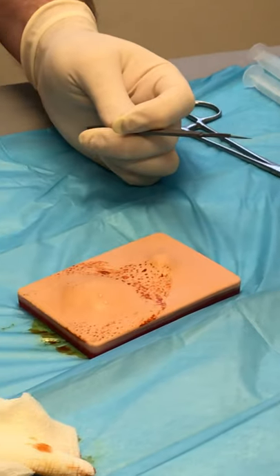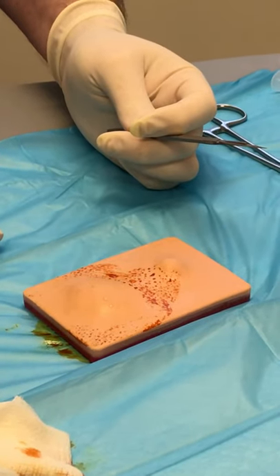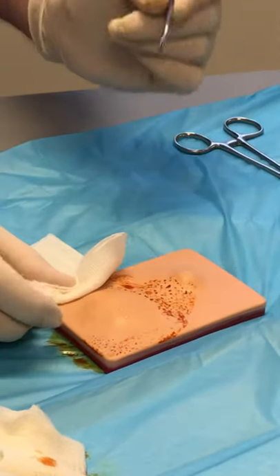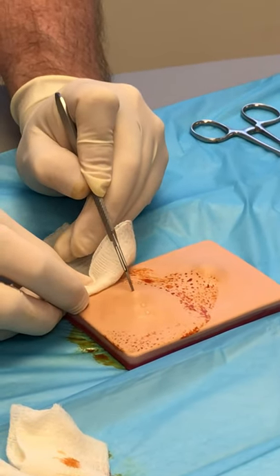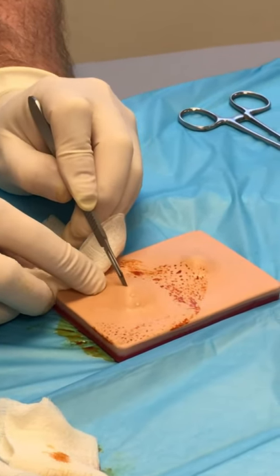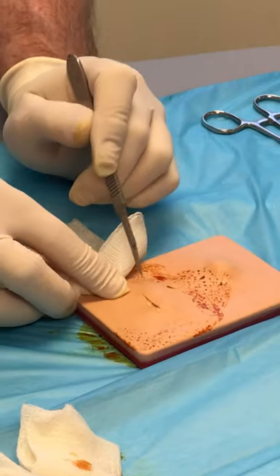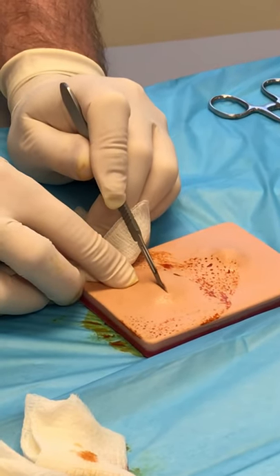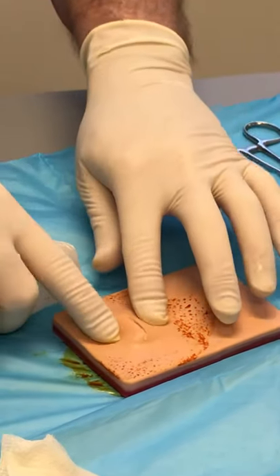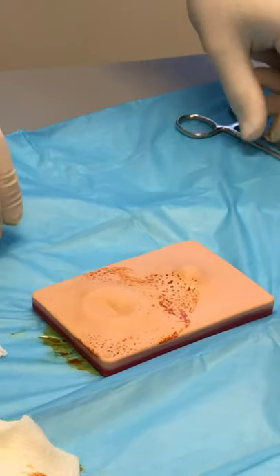When cutting these there can be a lot of pressure under there — think of it popping open like a zit; you don't want a face full of this stuff. If it's very tense, put on a gown, a surgical mask with face shield, and put something between you and the incision site. When I incise them, I usually hold the scalpel upside down to make the initial incision — poke like that. Usually this is under pressure and stuff will start gushing out. I want to incise about two-thirds of the way across.